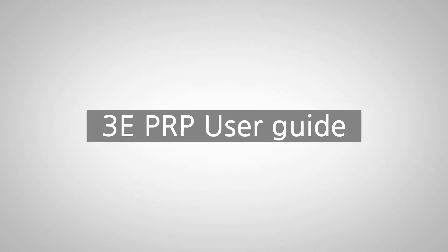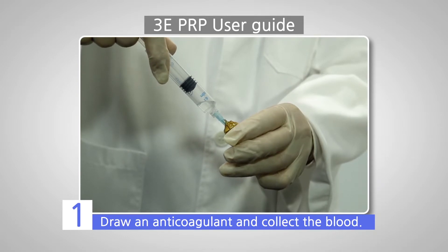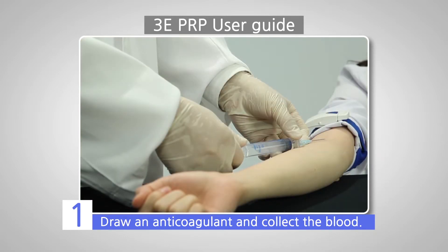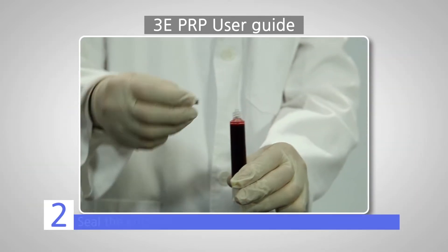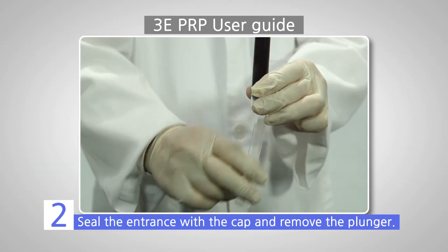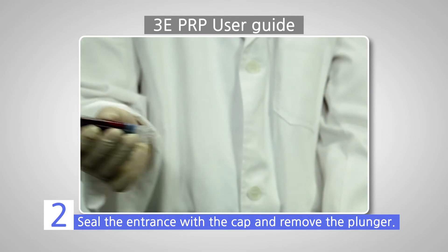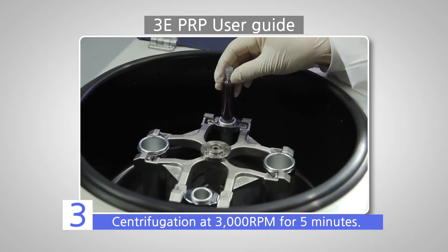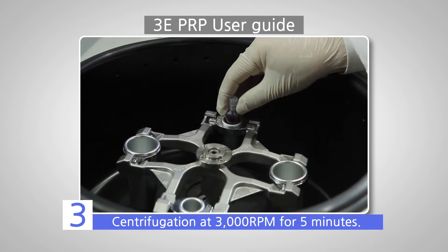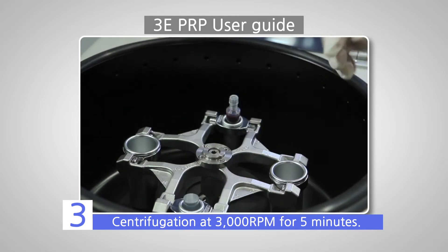How do you use 3-E PRP? First, draw an anticoagulant in the kit and collect the blood. Second, seal the entrance with the cap and remove the plunger by turning it counterclockwise, then shake gently. Third, run the centrifuge at 3,000 RPM for 5 minutes.